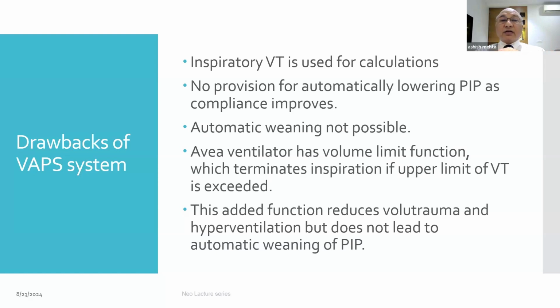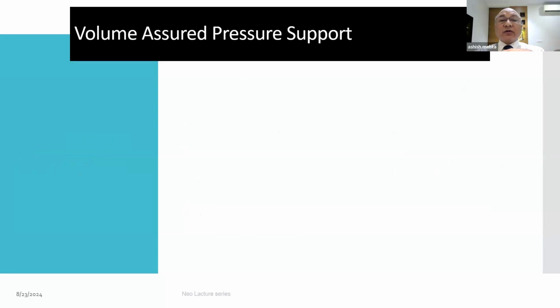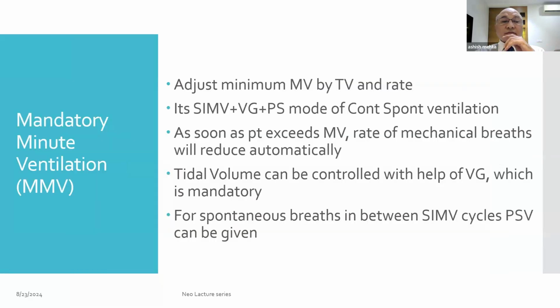Second thing is that there is no provision for automatically lowering PIP as compliance improves. And automatic weaning is not possible. That's the drawback of this particular mode.